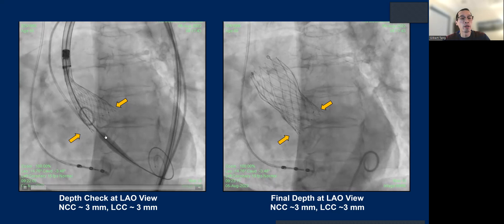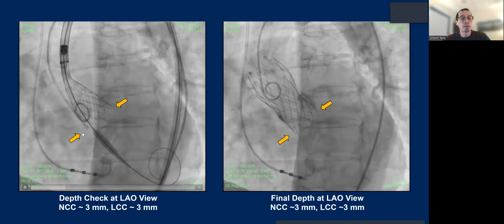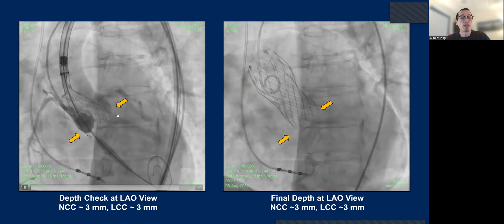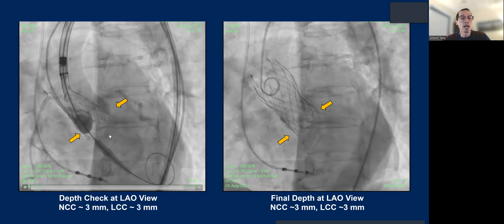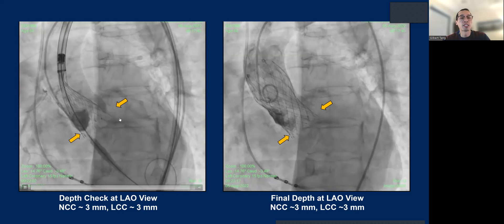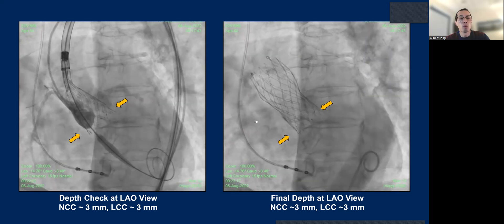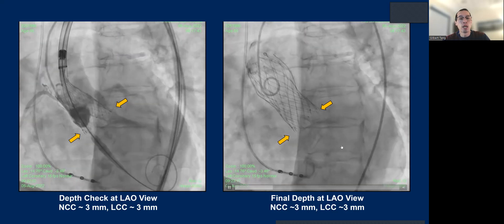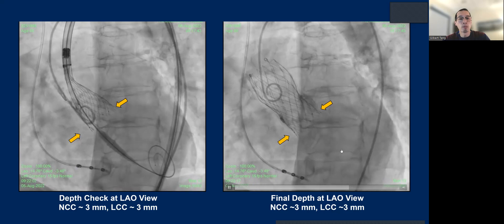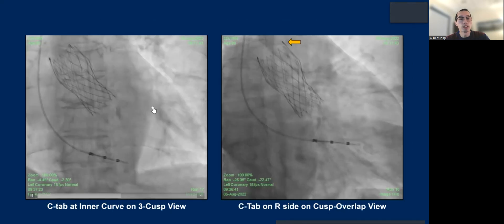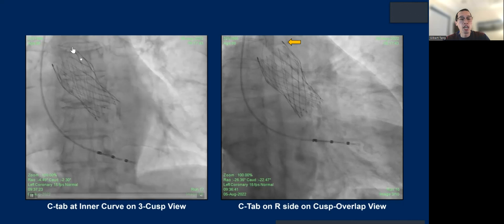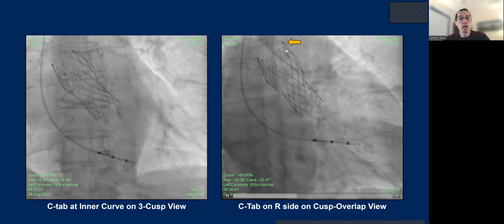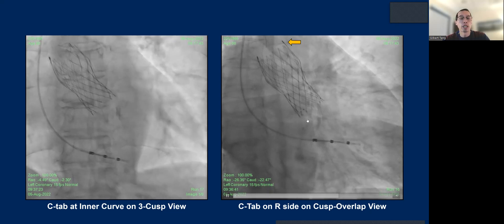On the LAO view, when you swing over to check the left cusp, all you need to do is line up the three dots and the parallax is removed. You can see a very satisfactory implant depth on both the non and left cusp. When you release it, the depth is pretty much the same as you expect at 80% deployment. The free cusp view shows the CTAP at the inner curve of the ascending aorta, suggesting good commissure alignment. On the cusp-overlap view, the CTAP faces the right side of the screen, again confirming commissure alignment.